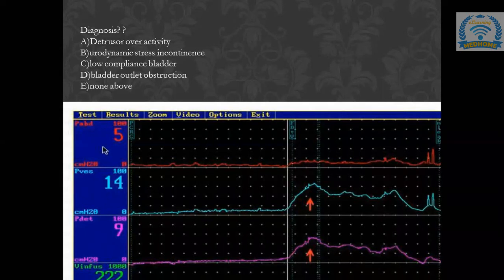And if both are rising and there is a leak, there is no mention of the leak, because that is in the below line that you can't see. Yes, I can't see the below line. Otherwise, below there's a leak as well. Answer is A.